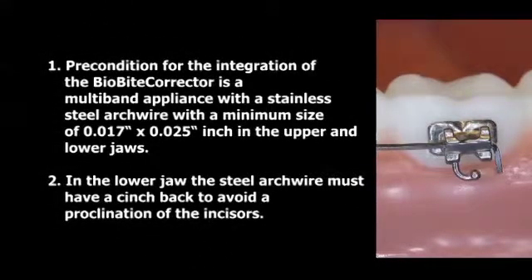Precondition for the integration of the Biobite corrector is a multiband appliance with a stainless steel arch wire with a minimum size of 17 by 25 in the upper and lower jaws. In the lower jaw, the steel arch wire must have a cinch back to avoid a proclination of the incisors.